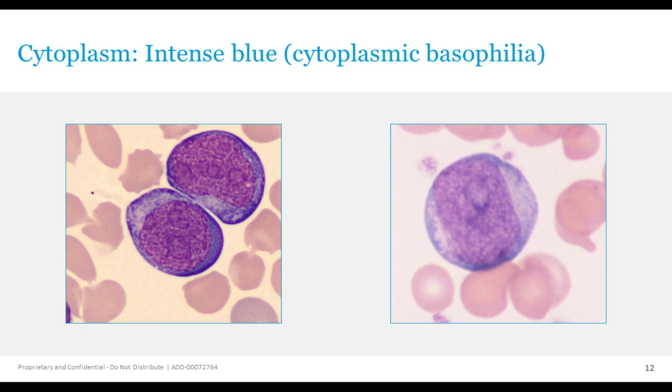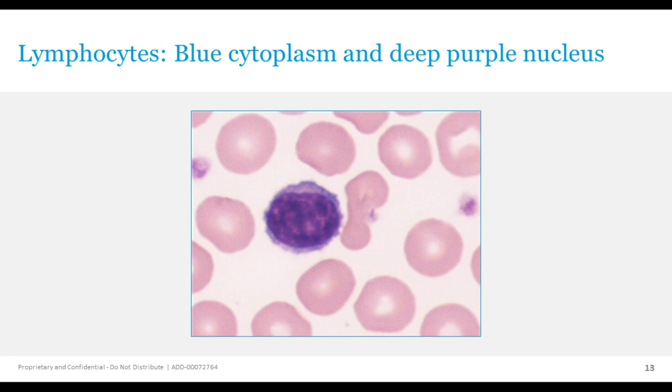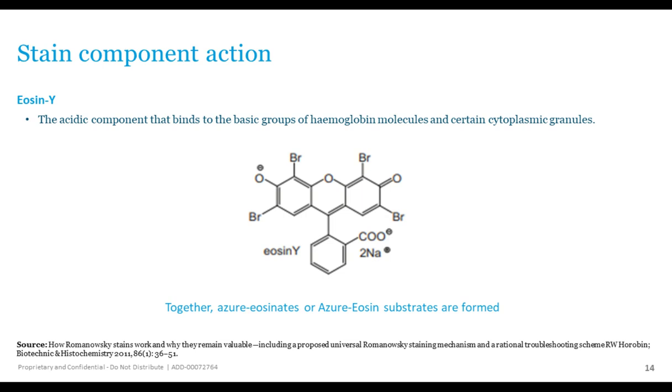Here we have an example of a lymphocyte — a more mature cell — with its dark purple nucleus and a small amount of blue cytoplasm around the outside. This distinction between the purple nucleus and blue cytoplasm is what allows us to say the stain is working well.